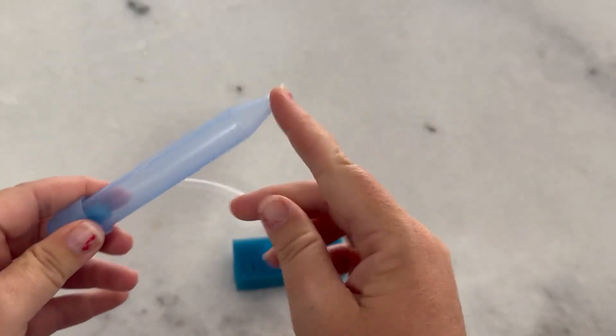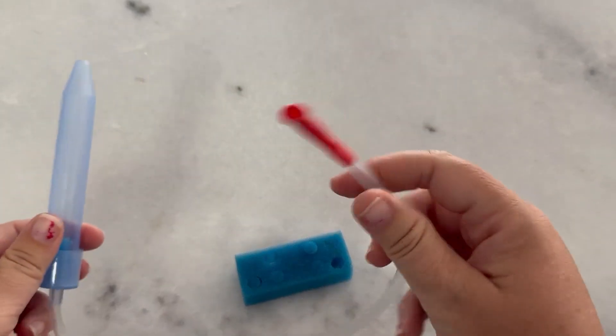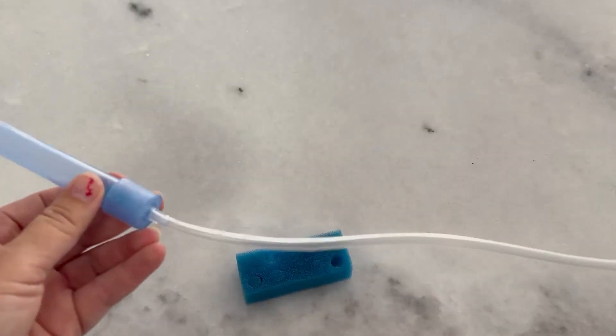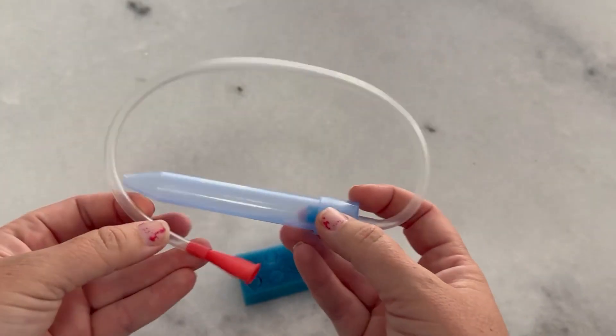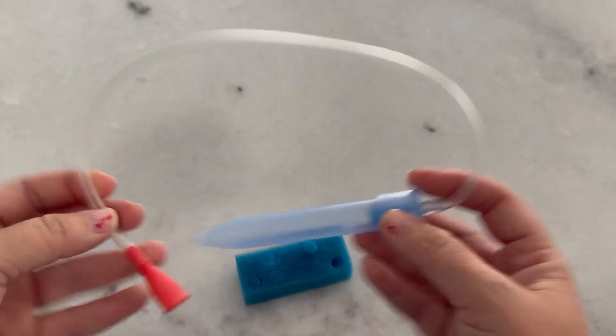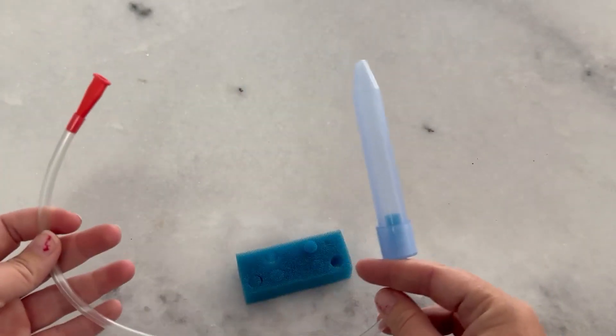You simply put this on the tip of the child's nose that's clogged and then you suck with your mouth here. I like it because there's absolutely no way that the snot can get up into your mouth. That's what people usually freak out about with the Nose Frida.